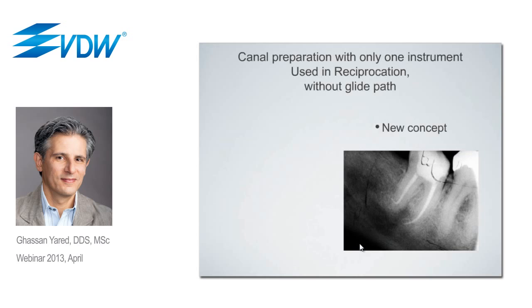And well, today I want to present to you this new concept, using the canal preparation with only one instrument used in reciprocation without creating a glide path in most of the cases, and even without the need for using hand files before using the Reciproc instrument.